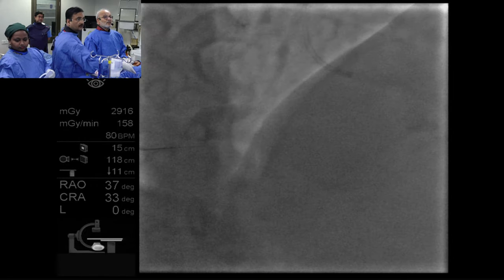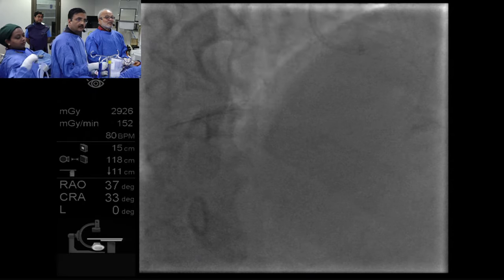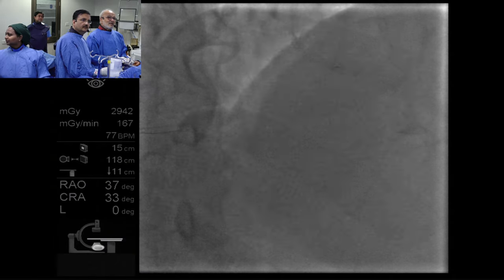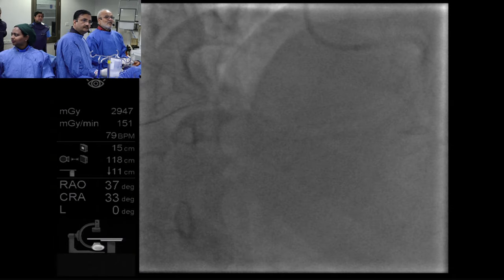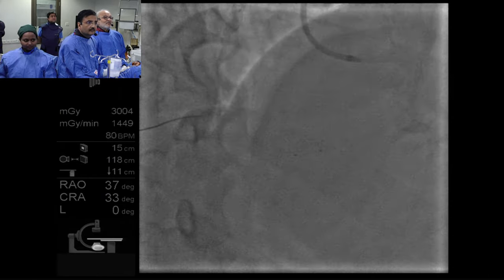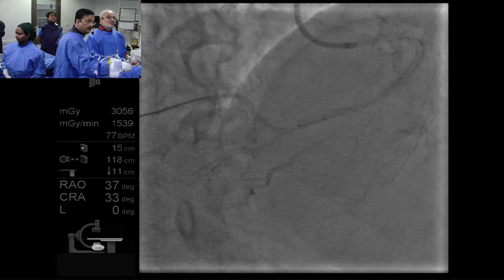Yes, I am Uday Mahavarkar from Nagpur here. Don't you feel uncomfortable with that slightly hazy looking proximal lesion? Why not OCT? It is, I tell you, it is calcium. We can do that. But this is calcium, Uday. Yeah. You came, I never knew. Then we will take your advantage. I will take your advantage on the panel also.